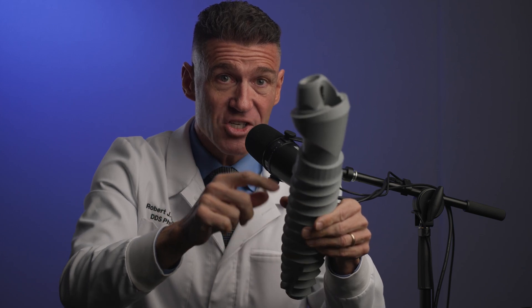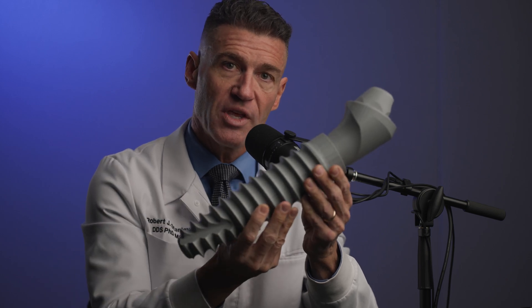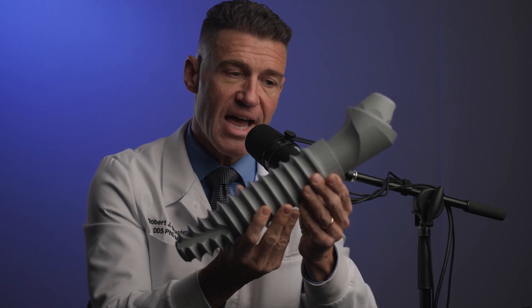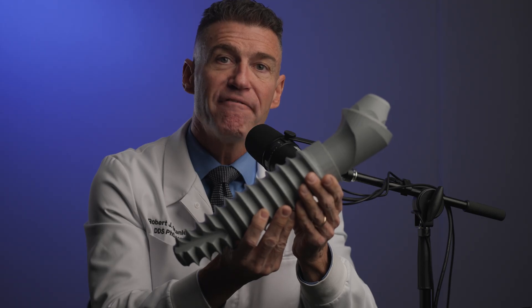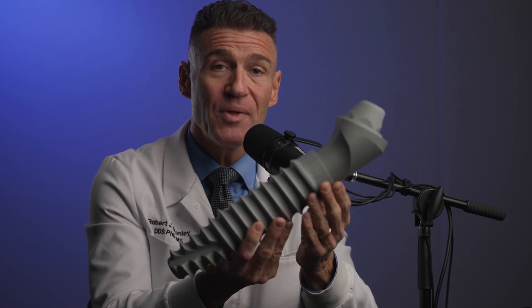Not only did it go in, but it actually sealed — it actually engaged the cams, rotated, and fell into position. You cannot do that with a shallow conical seal with a hex. So the first time I used this with an angled multi-unit on an all-on-X solution, it went right in within a second — I was shocked. And the reason I'm shocked is that no one talks about this feature with the deep conical seal, and it is by far the single most important thing. It's easy to use — it just falls into place.